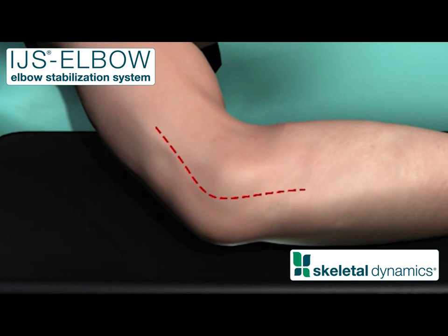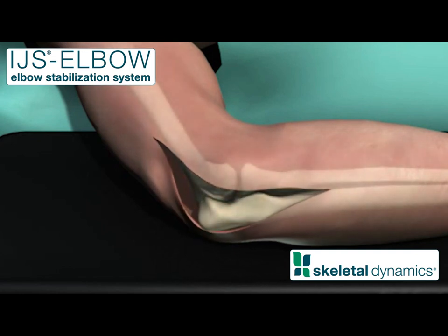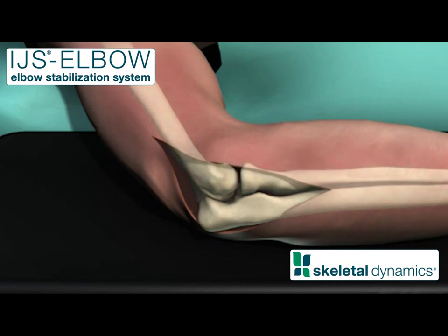Make a 12 to 15 centimeter incision midway between the lateral epicondyle and the olecranon. Develop flaps to expose the subcutaneous surface of the ulna and the lateral aspect of the elbow. Approach the lateral aspect of the elbow joint.